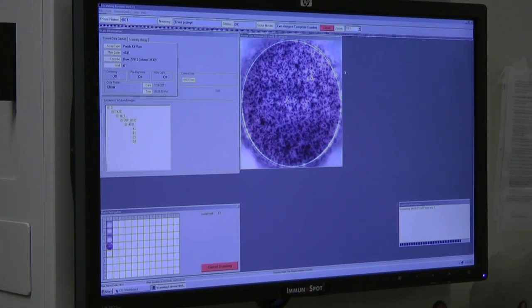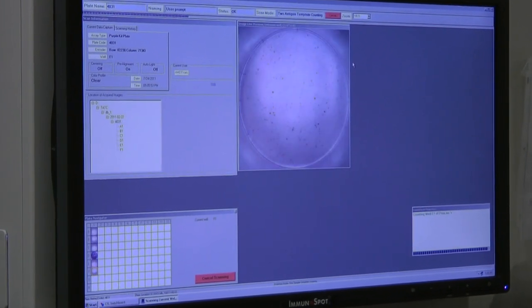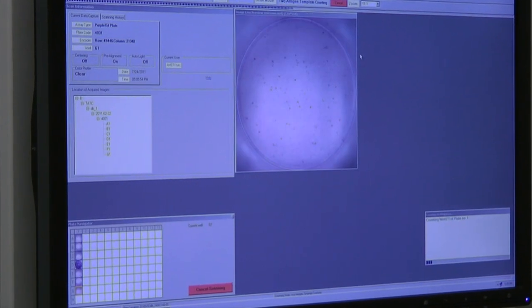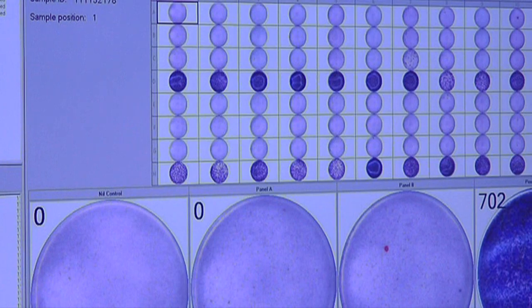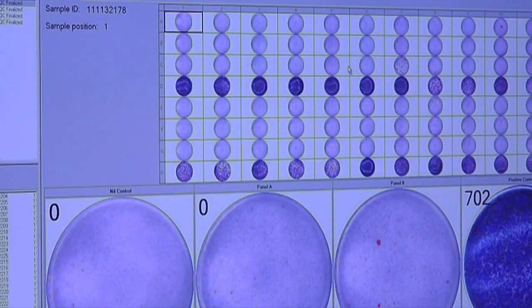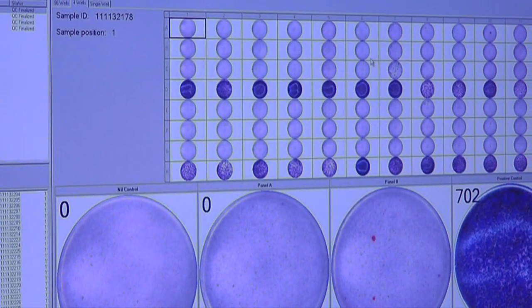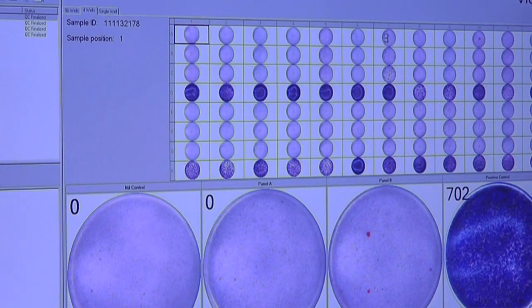This is done by capturing interferon gamma in the vicinity of T-cells purified from whole blood. This video will cover the pre-analytical, analytical, and post-analytical test processes and demonstrate how laboratories can improve sample throughput through a suite of automation.